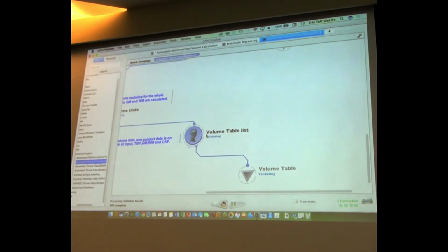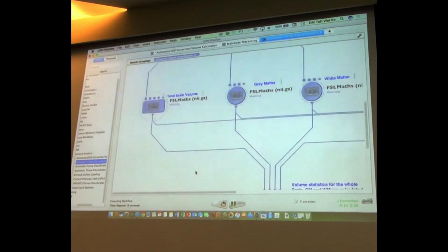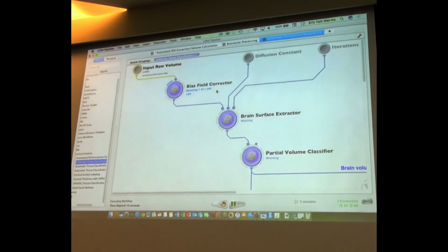That's an end-to-end workflow. Now these can be added at the end, again, to augment your clinical scores as covariates or something, either in a classification setting or in some kind of other model-based prediction. So there's various things that we can analyze. Again, most of these things will take time to finish, as you can see.